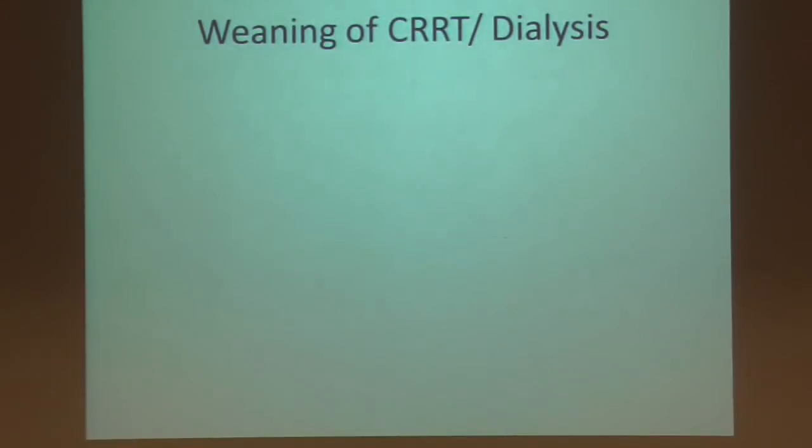Weaning of CRRT, you'll see a little subset on this. Essentially, it's, are they making urine again, or is the delta creatinine still up? Normally at this time, after about a day or so, actually our partner and I practice about the same. We'll run them initially, maybe run them the whole day, and then kind of give it a break to see what's going on, and then go from there. That's essentially weaning of CRRT. I think they try to do this to be like a pulmonologist, but we're not sophisticated.